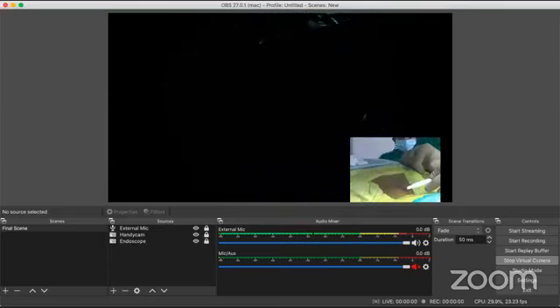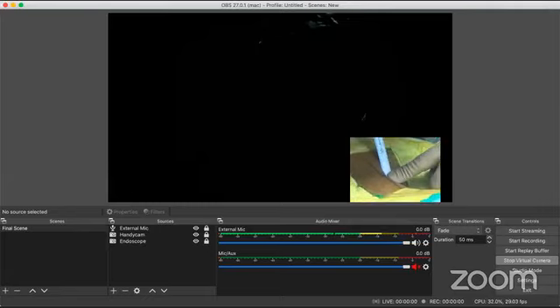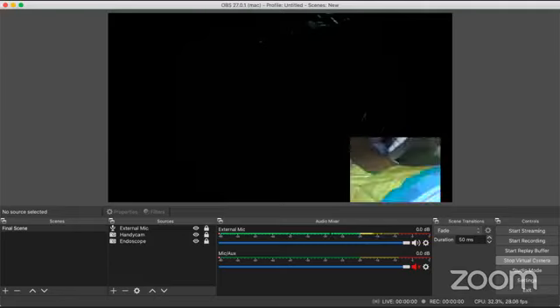So I marked the midline, I marked the lateral facetal line, I marked my points to the spinolaminar junction, which is exactly 3 centimeters apart. Give me a tape please. So if I take a tape, I am exactly 3 centimeters apart. So my instruments will not get crowded. My instruments will be nice and comfortable. But I want to reach this point. This is the point I want to reach.